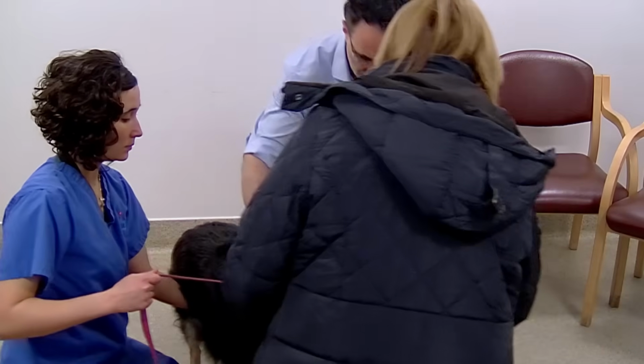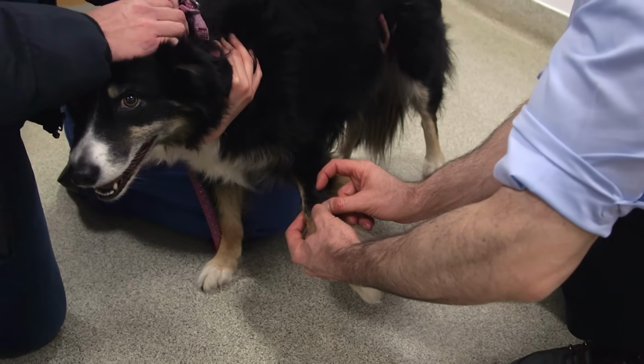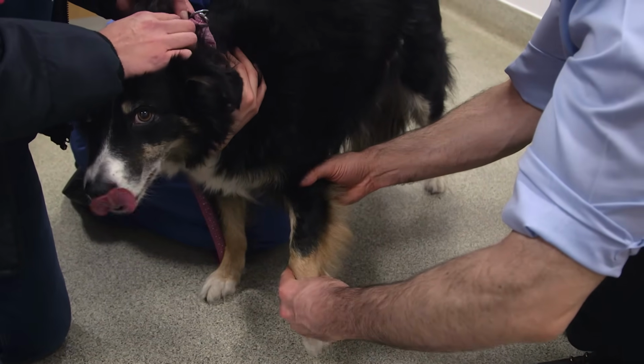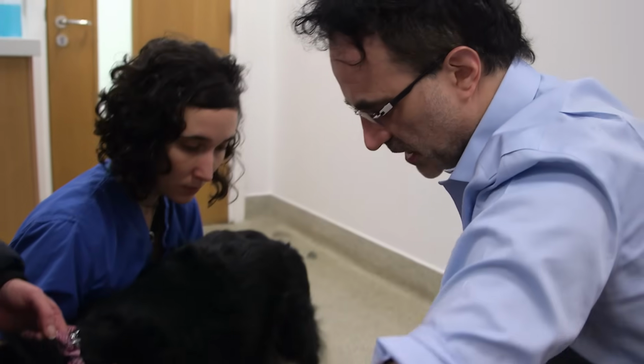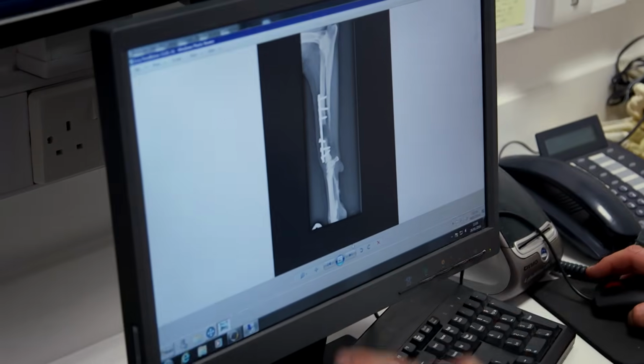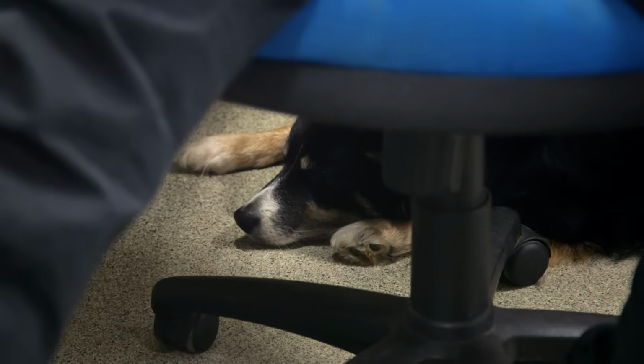All right, sweetheart, let's have a look at you. So that's loose in there. So it's broken in here still. Then obviously it's painful. Easy. And I can understand your reluctance to take the leg off, because actually the rest of the leg's fine. The foot is fine, the tendons are fine, and the leg is still working. You can't leave it as it is, because the foot's going to fall off. Anytime now, those 3 screws will give out and you'll have a fracture with the foot hanging off. And option number 2, chop the leg off. That's up to you. And bear in mind, it is your decision at the end of the day.